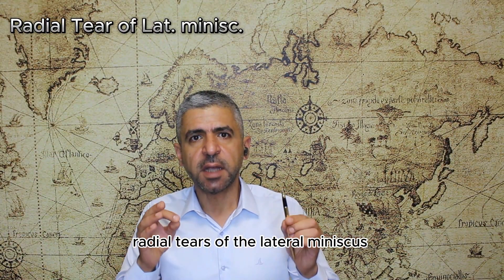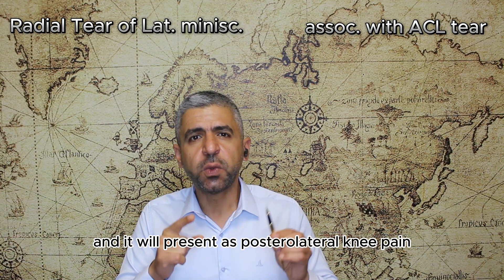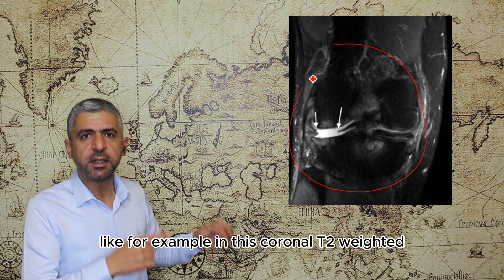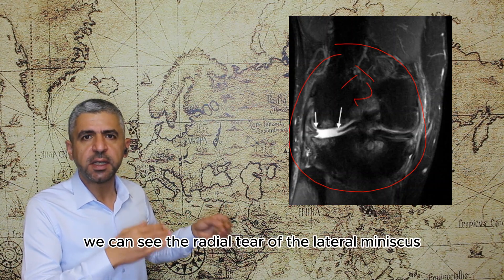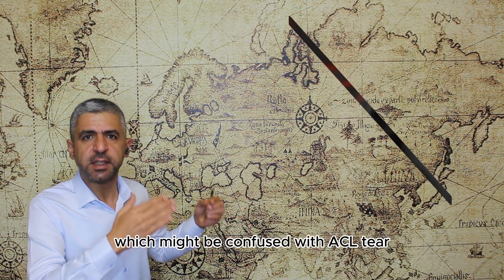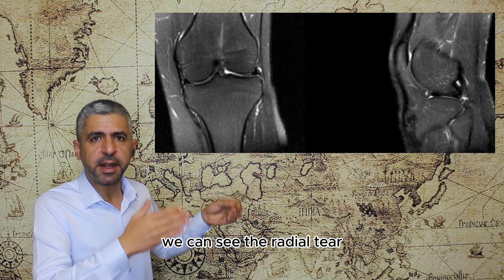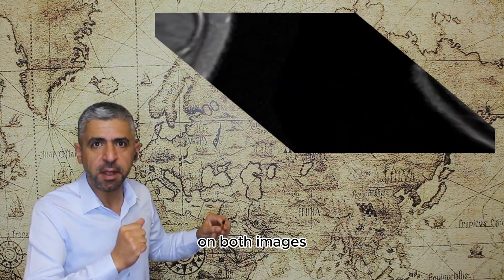Radial tears of the lateral meniscus are associated with ACL tears and present with posterolateral knee pain. On this coronal T2 fat saturated image, the radial tear of the lateral meniscus may be confused with ACL tear. Another example on coronal and sagittal images shows the radial tear involving the lateral meniscus on both views.